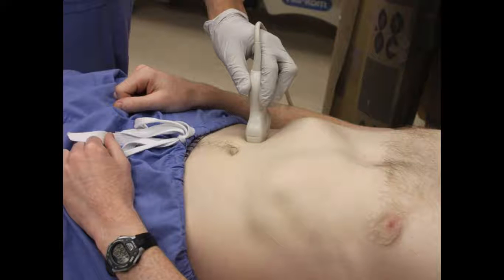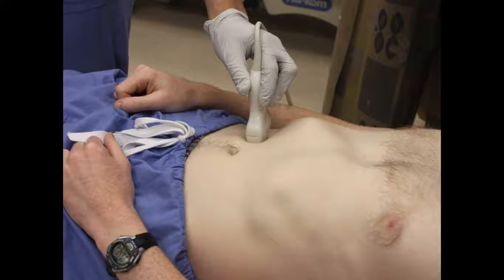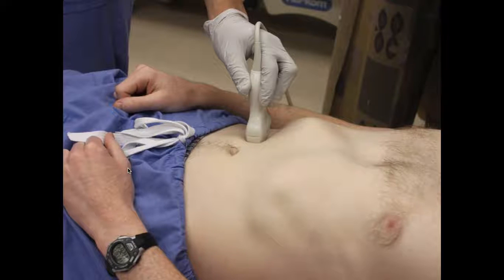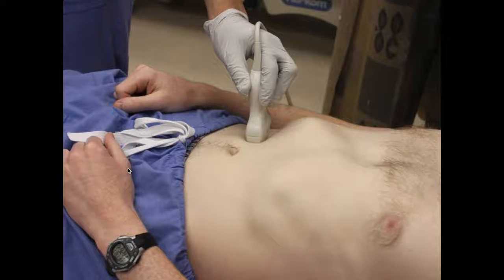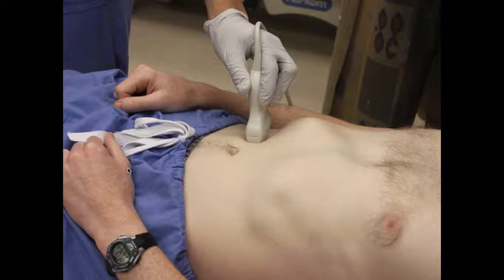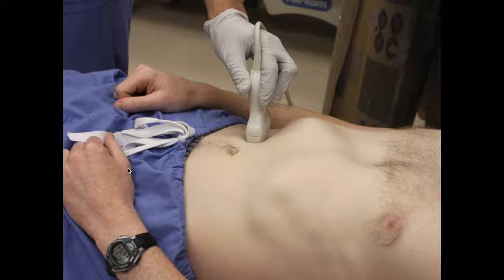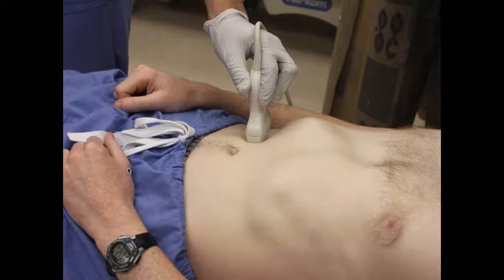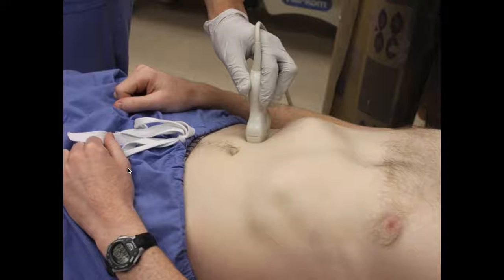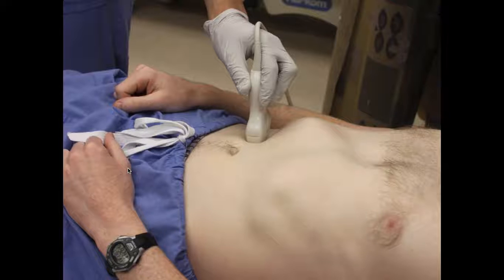When you actually place the probe on the patient, you can put the probe wherever you want. However, I would suggest starting in the right and left lower quadrants. The reason for this is that a lot of small bowel obstructions are going to have air fluid levels — air layers anteriorly. And if you look anteriorly first, you're only going to see the air, which is going to be represented by A-lines. However, if you start in the right and left lower quadrants, a little more lateral, you're more likely to see the fluid in the small bowel obstruction.